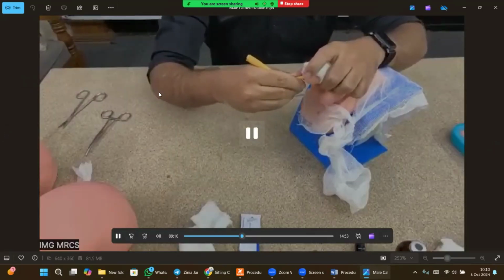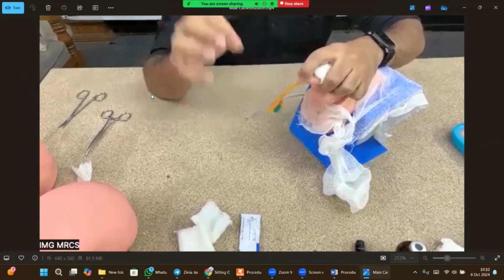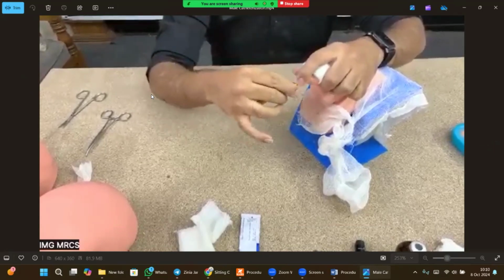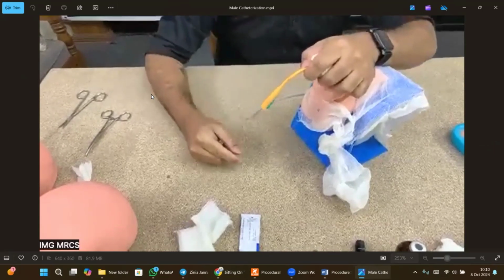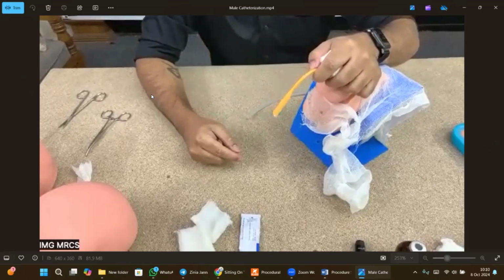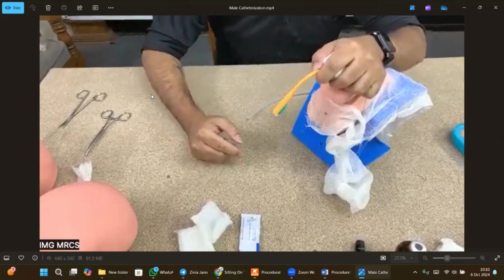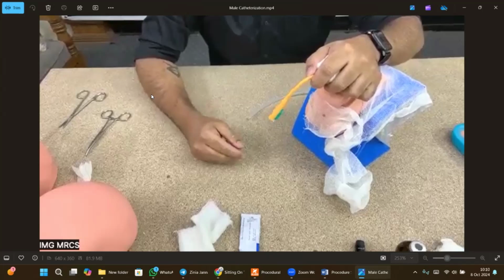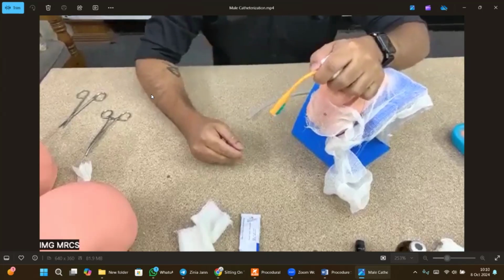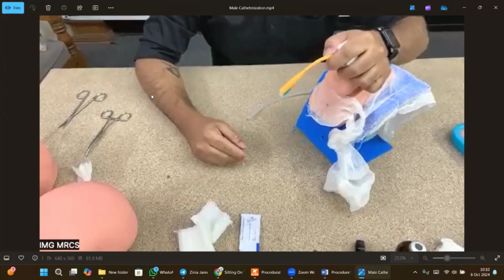Okay, this is a tricky question. Most of the candidates who have gone for the exam say, okay, you can wait till we are done with our procedure, after that you can drink. This is not the correct way of mentioning things. This is not professional. So you have to mention, yes, you can just wait a second. Can you please, you are saying this to the assistant or the examiner, arrange some water for the patient? The patient needs to drink, all right? And then the examiner will mention, okay, consider it done.